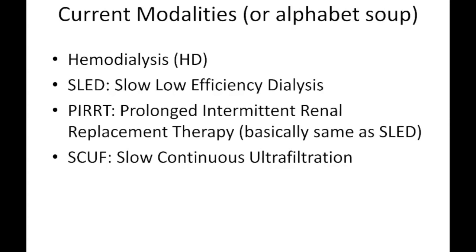SCUF, which you may hear more frequently in settings of heart failure and CCU type admissions where this has gained some interest, is slow continuous ultrafiltration. And this is basically that convective clearance idea where we're just removing plasma water, removing a little bit more solutes due to the difference in pressure, but generally very little in terms of cleaning of the blood, mostly just removing fluid from those patients. And there are times when a patient may have a near normal creatinine, but the volume overload is so excessive that they can require a therapy like this SCUF, which is kind of like SLED without much blood cleaning.